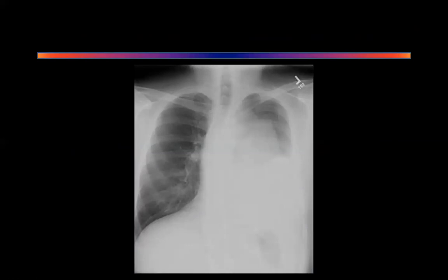Does this look like a pleural effusion to you? No, actually, what do you get in a pleural effusion? The pleural margin goes up as the fluid will sweep. What do you think is more likely? I'm not denying that there is effusion here. There may be effusion. I agree with you. But what is more likely? Can you see this? What is all this happening here? Is that the collapsed lung? Lung is here. Pneumothorax. No, this is the lung.